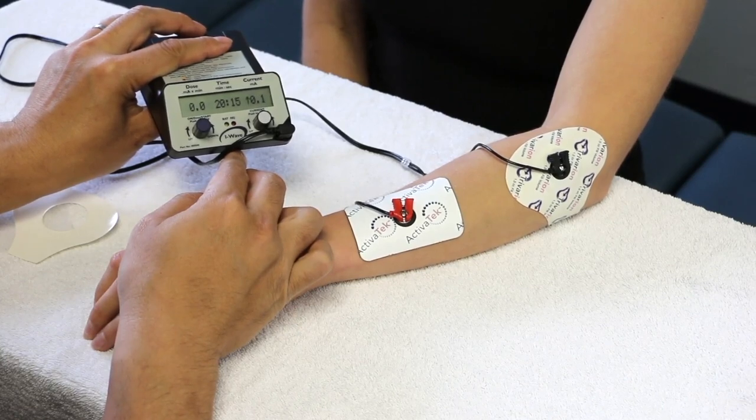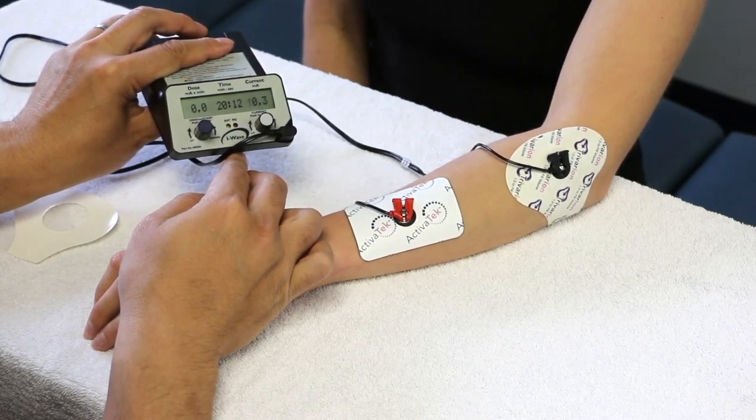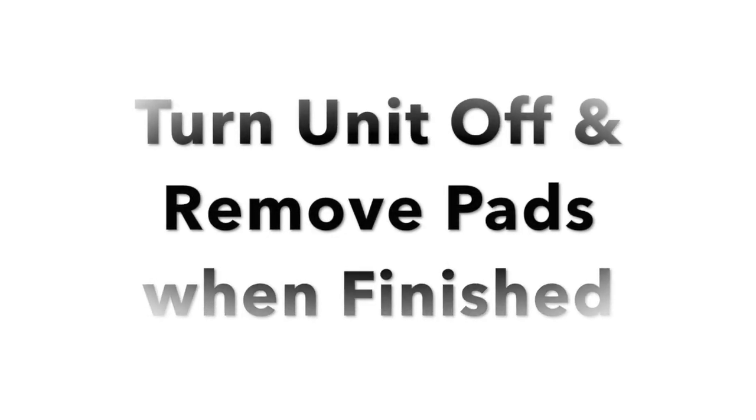When the treatment session is complete, turn off the unit, gently remove the electrodes, check the condition of the skin, and assess the patient's symptoms.